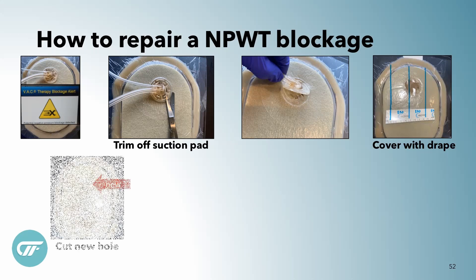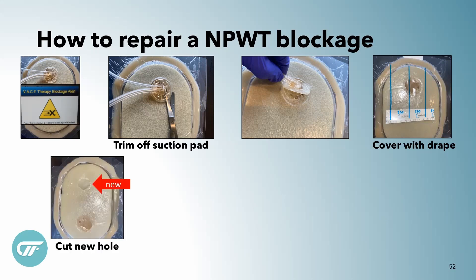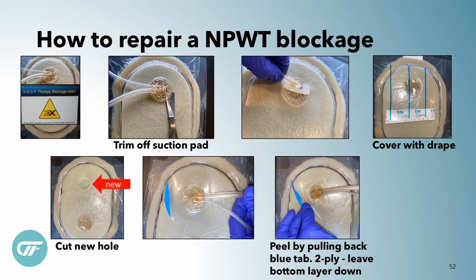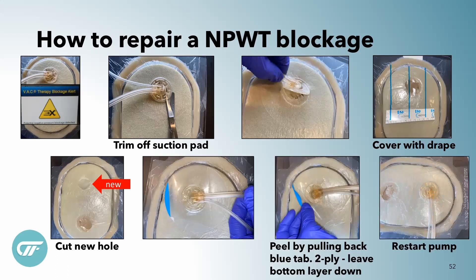Obviously we would do this on off-change days — you wouldn't need to be changing the dressing. We're doing this to allow the dressing to stay in place. And so then I'm going to cut a new hole and I'm going to put a new track pad down and then pull back your blue tab, and voila — you have fixed your blockage alarm and you are back at it with your negative pressure.